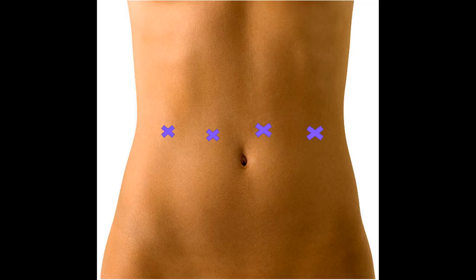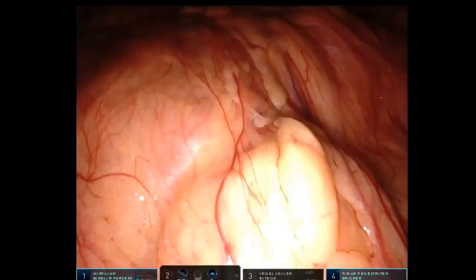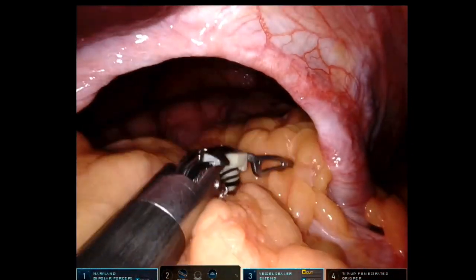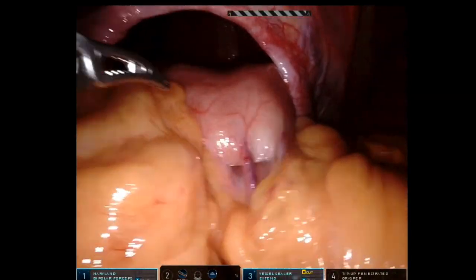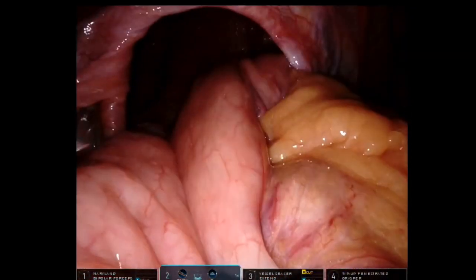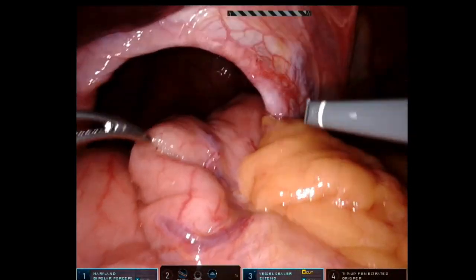This repair is done with four 8-millimeter ports. The operation starts with the liver retractor that pulls the left lobe of the liver up so you can see the esophageal hiatus. As you can see, this hole should not be present — it should be a tight opening around where the esophagus enters the abdomen, and the stomach, as you can see, is pulled up into the chest.